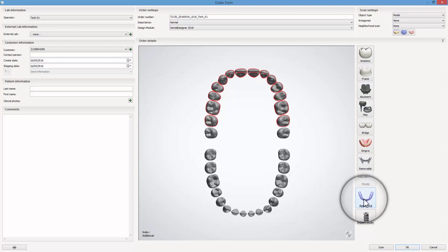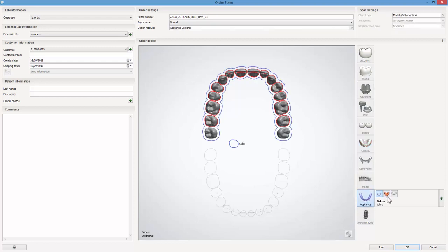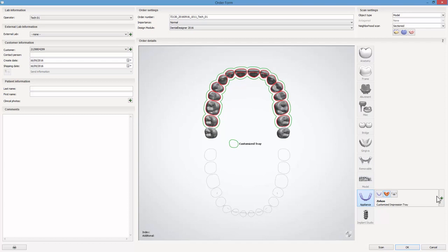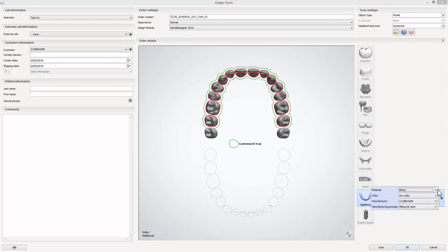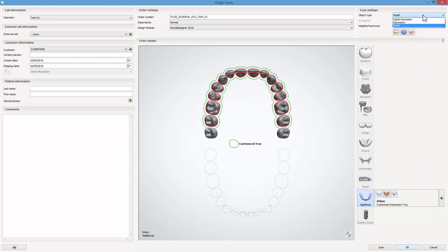Click the appliance button and then the customized impression tray button. Now choose the material type. Remember to select the appropriate object type for the order, either Impression or Plaster Model.